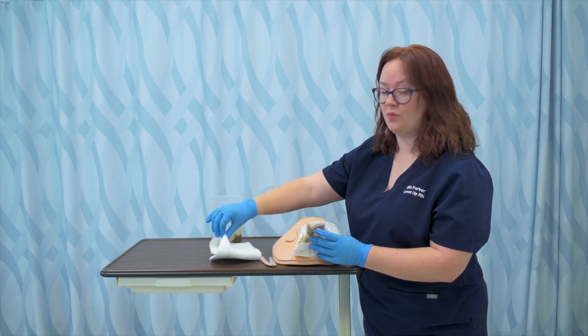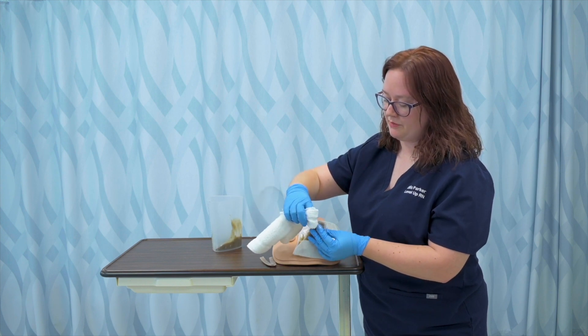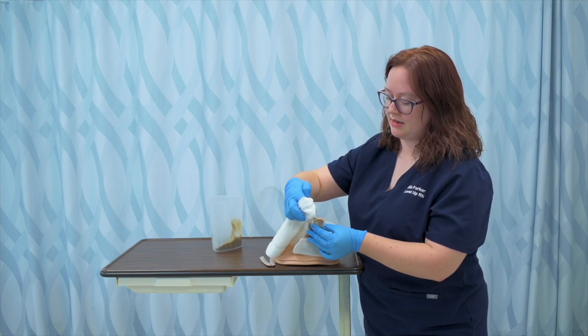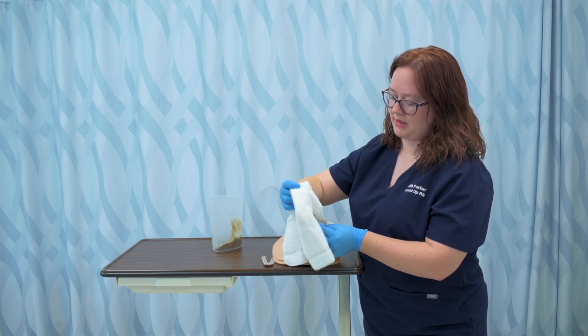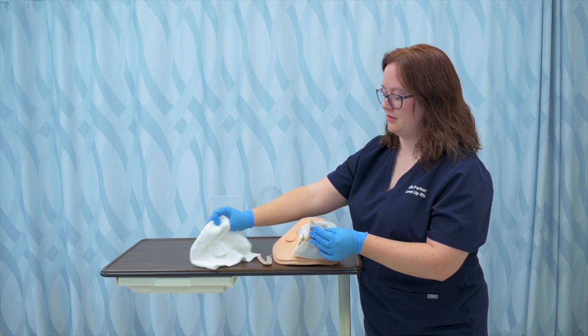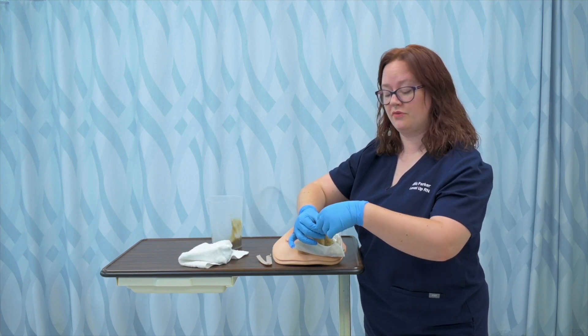I'm going to use a washcloth, but a piece of paper towel or toilet paper is even okay. I'm just going to wipe the edges and make sure I don't get any on the external part of the bag to reduce the potential for contamination and the potential for smell.